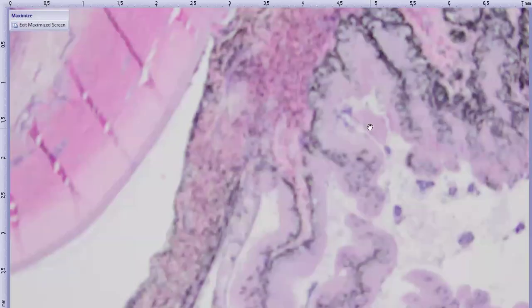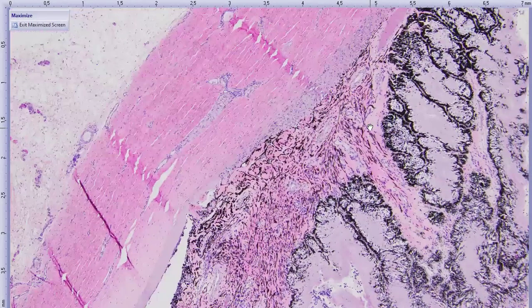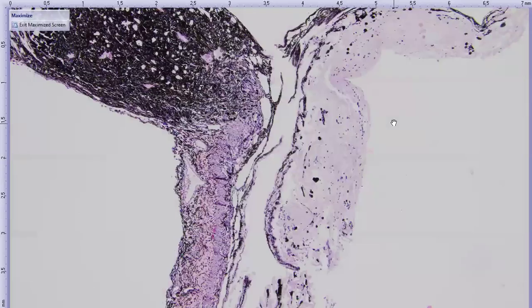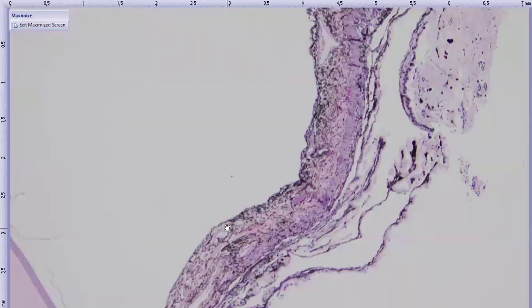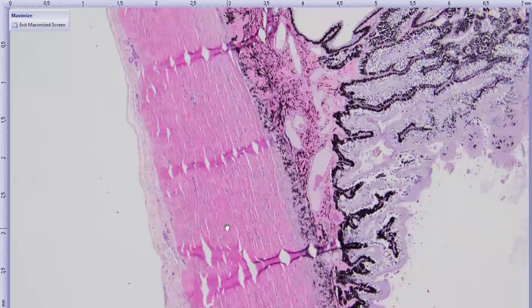Some other neat features in this eye. The anterior chamber was narrowed, and then if you look at the iridocorneal angle, you can still make out pectinate ligaments here, and then maybe where the trabecular meshwork or especially the uveoscleral meshwork would be, but it's quite narrow to collapsed in this case, along with the narrowing of the anterior chamber in general. Again, maybe there's synechia, but I'm not necessarily convinced at this level. There's something on top of the corpora nigra here, maybe a fibrovascular membrane. Kind of suspicious that there's some degree of anterior synechia though. And then the same sort of thing with the angle on this side.